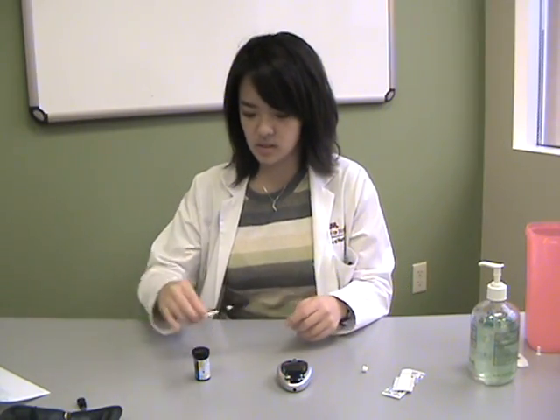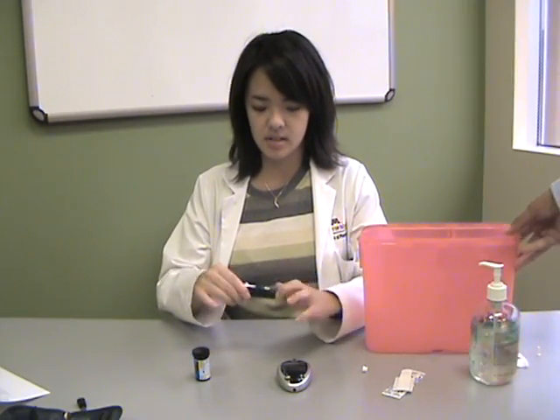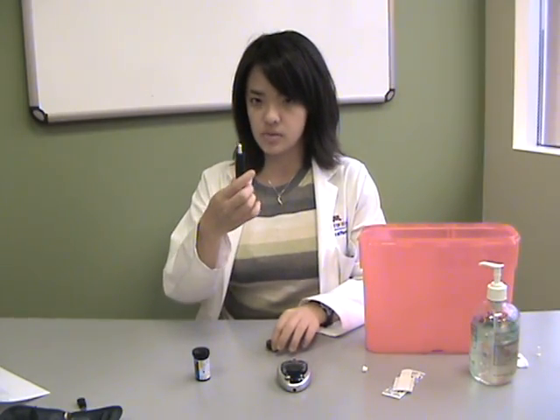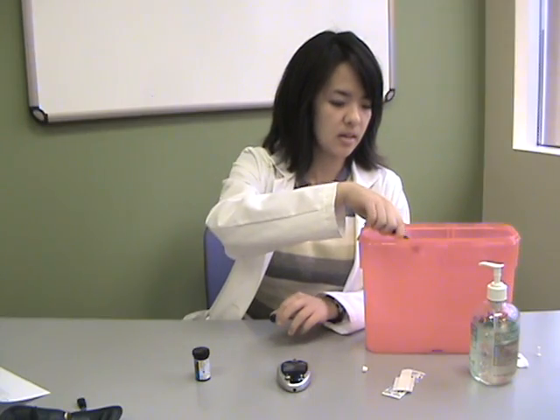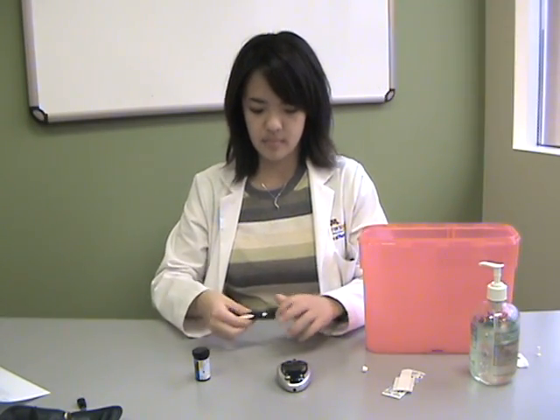And that's how you test your blood sugar level. At the end of testing, you will want to dispose of your lancet properly in a sharps container. And that's all.